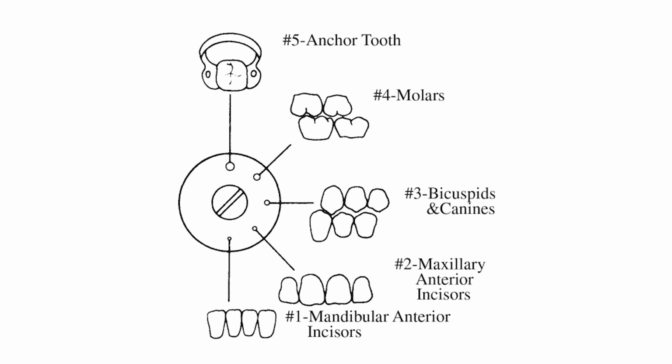Our fourth tip is not to punch a hole too large for the tooth. What ends up happening is the rubber dam sheet ends up sliding back up the tooth if it's too big. Generally, for a molar tooth, use the second largest hole. But when you have a clamp, for the clamped tooth, you can use the largest hole available. This way, when you use the correct size, the rubber dam sheet goes snug right against the cervical margin of the tooth.